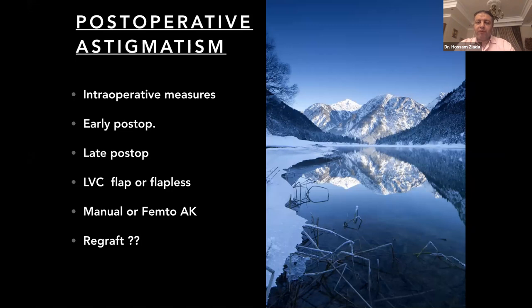I had a residual of -2, -3 astigmatism, and I corrected this residual with a femto AK, astigmatic keratotomy, which corrected up to 70% of the residual part. But put into consideration PRK as the first line, and LASIK, because I have done it, I may say it could be done. Manual or femto AK, we discussed that.